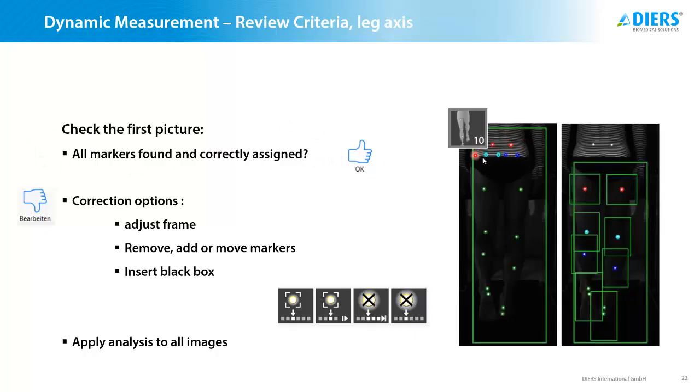In this case, on the left image, they are not, because the system does pick up the dimple points and does pick up some reflection points along a projected line just above the underpants. As you select in this case 10 measurement markers, not the pelvis, you can crop the frame, so adjust the frame in such a way that you discard the upper area.